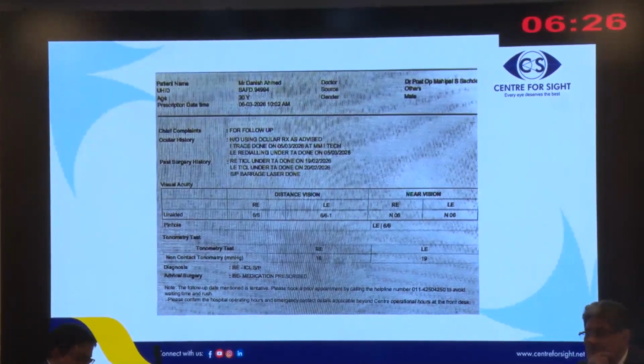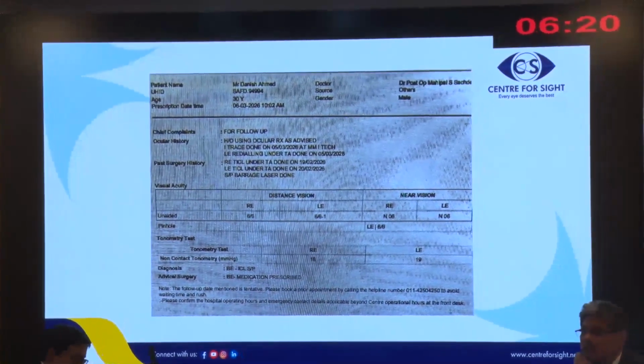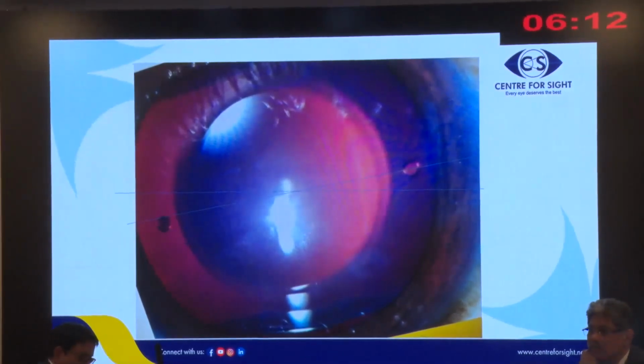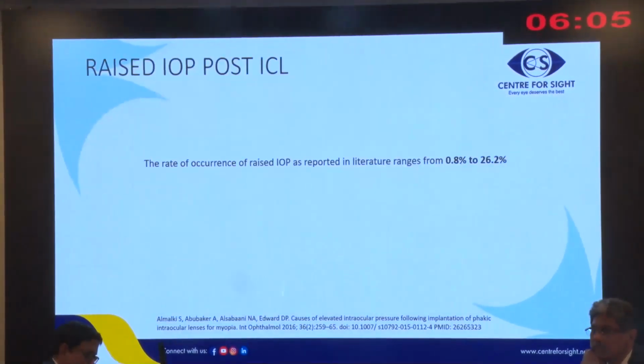So basically, I think most probably it's a calculation error. Despite my having done ICL since 1999, this is the first time with an ICL that when I rotated it down 10 degrees instead of up, where it was at 160, I've got 6/6 vision now. But it's better to cross-check what has come and what needs to be done. So that is something important.